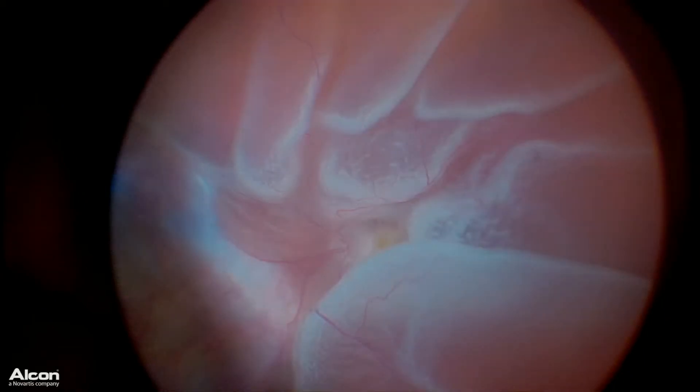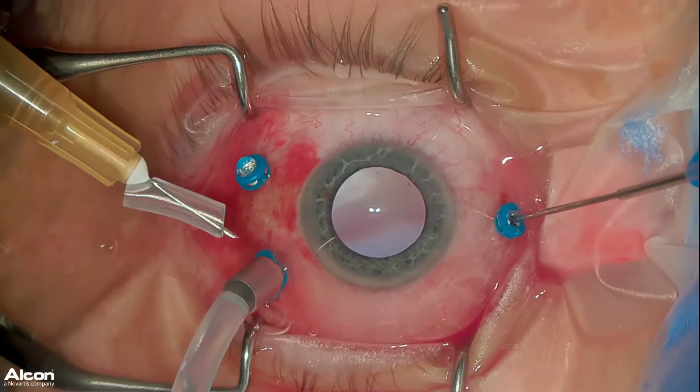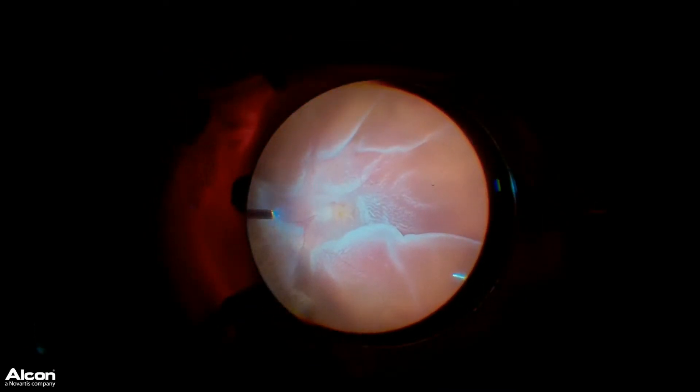This is a really unique case. This is a patient that had ocular toxoplasmosis-related uveitis and had developed a retinal detachment. He had some scar tissue called proliferative vitreoretinopathy.